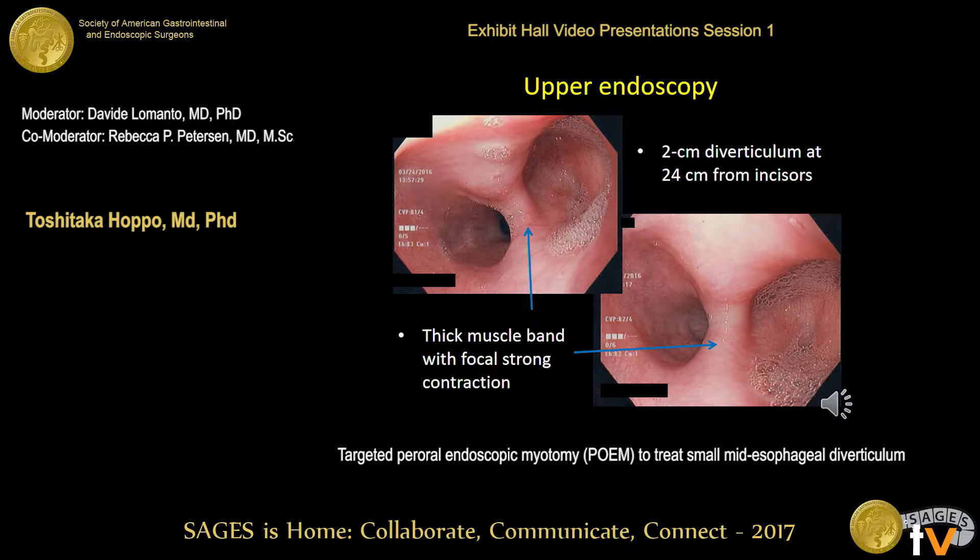Upper endoscopy demonstrated a two-centimeter diverticulum located 24 centimeters from the incisors. There was a thick muscle band with focal strong esophageal contraction between the diverticulum and the esophageal true lumen. I felt a popping sensation when I passed the scope through. Based on these endoscopic findings, the thick muscle band seems to contribute to the development of the small diverticulum and her symptoms.